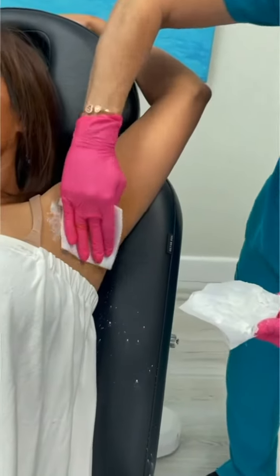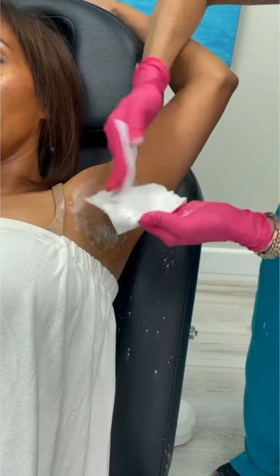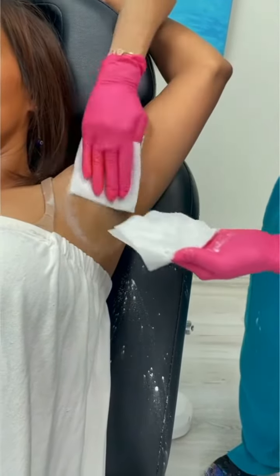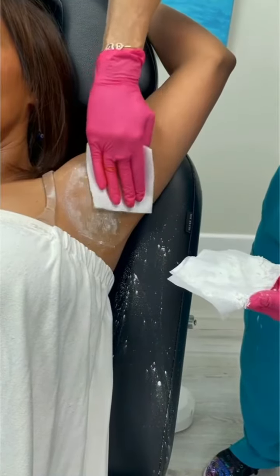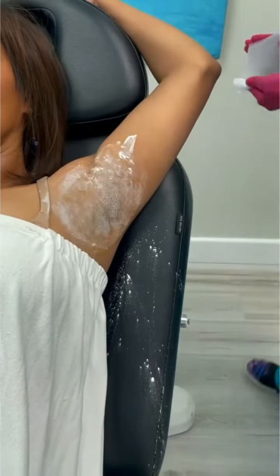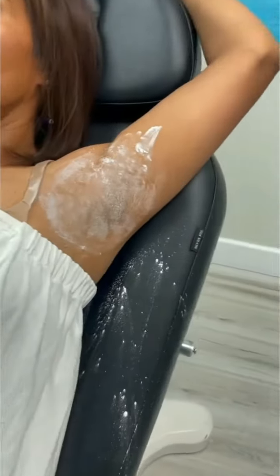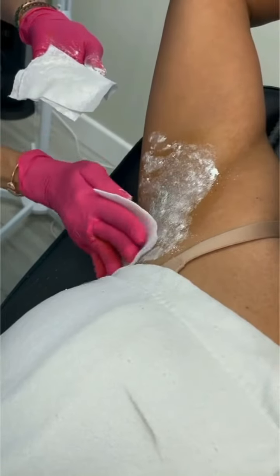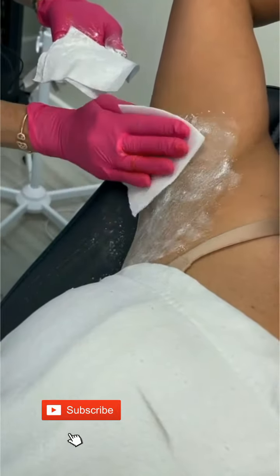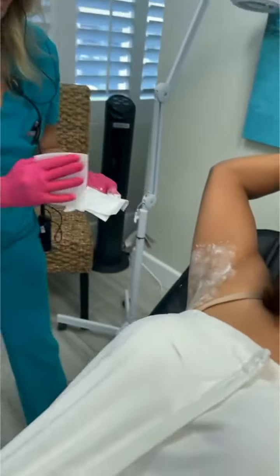So now we are taking cornstarch and we are going to make a mess — we are going to put cornstarch on her armpits. I want a bunch; don't worry, it cleans off really easy. Now if she doesn't sweat on her own in a few minutes, this will turn a bright purple where the sweating is occurring.